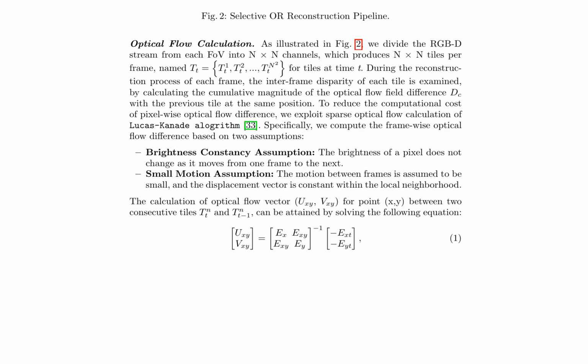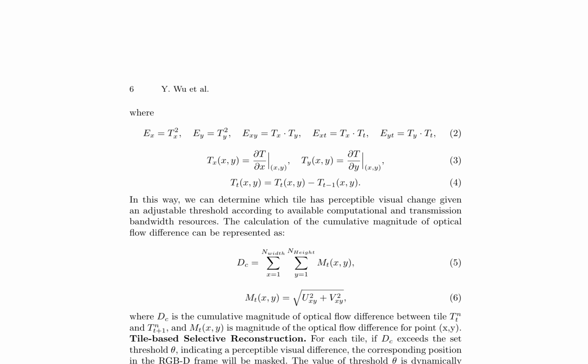To further optimize data transmission, TeleOR utilizes viewport-adaptive transmission. By gathering users' past field of view (FOV) movements, an LSTM network predicts the user's next FOV, enabling strategic synthesis of point clouds solely within the predicted area. This approach ensures efficient bandwidth utilization by transmitting and rendering only the scene segments likely to be in the user's view.